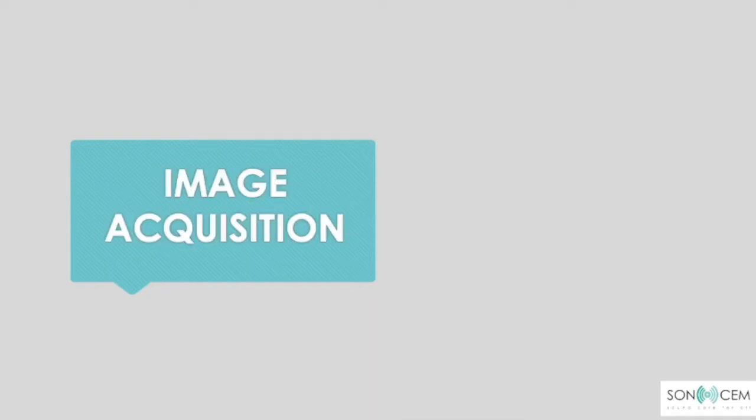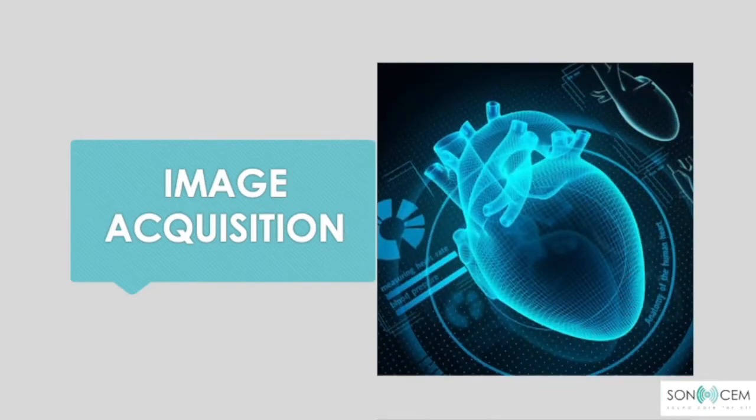Just now, we talked about some principles in cardiac ultrasound. Now we move to the image acquisition. In this basic cardiac ultrasound, I will mention four basic views, which are parasternal long axis view, parasternal short axis view, apical four chamber and subcostal four chamber view. And I will touch a bit on IVC scanning.